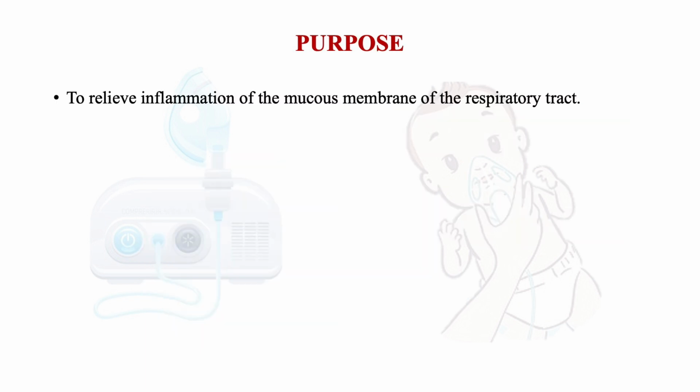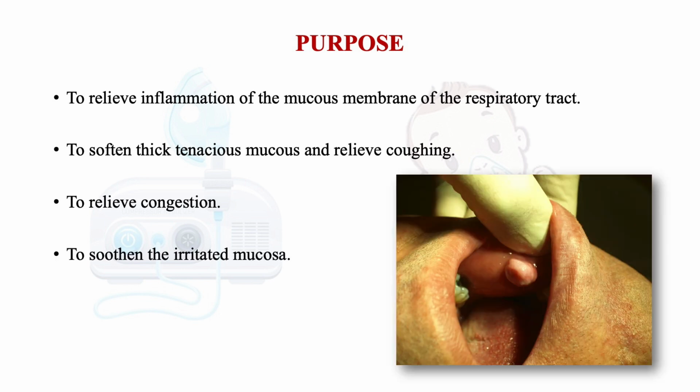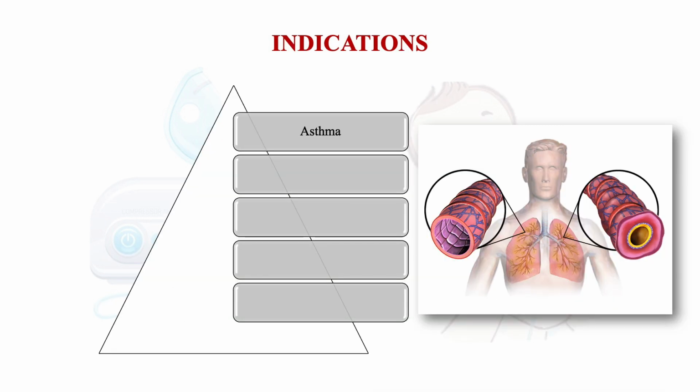Coming to the purpose of nebulization, nebulization serves various purposes. It acts to relieve inflammation of the mucous membrane of the respiratory tract, to soften thick tenacious mucus and relieve coughing, to relieve congestion, to soothe the irritated mucosa, and it causes bronchodilation.